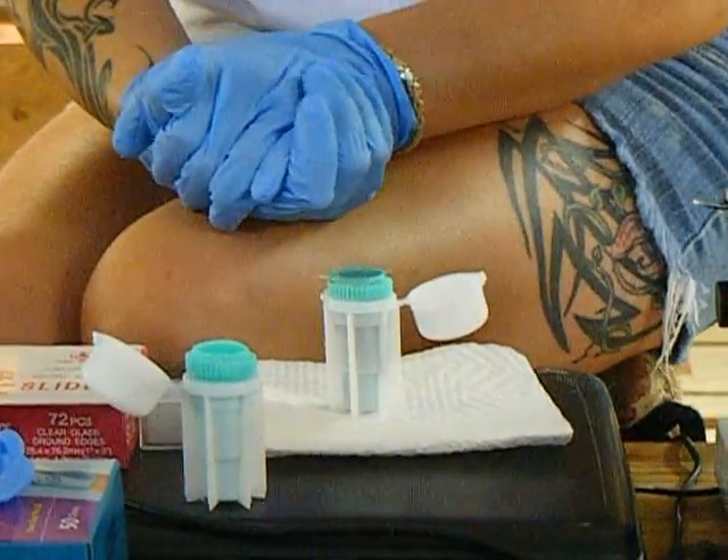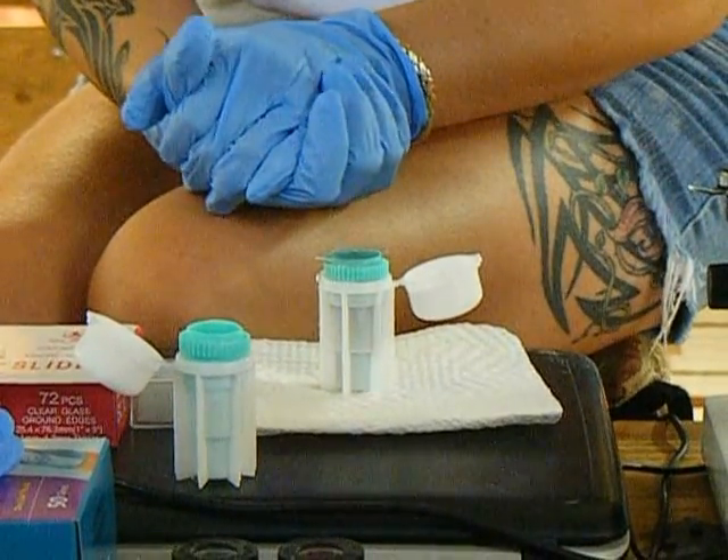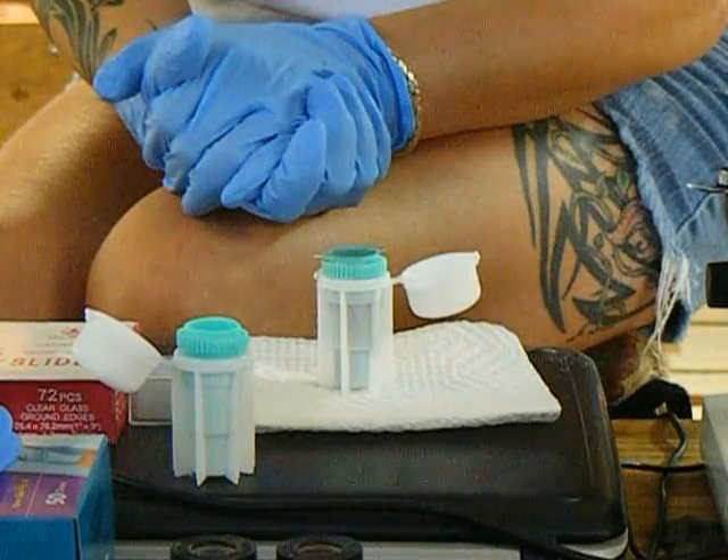Then it's the waiting game. You have to wait about 10 minutes — you shouldn't wait any more than 10 minutes or so. We're just doing a demonstration, so we're not going to wait the whole 10 minutes.